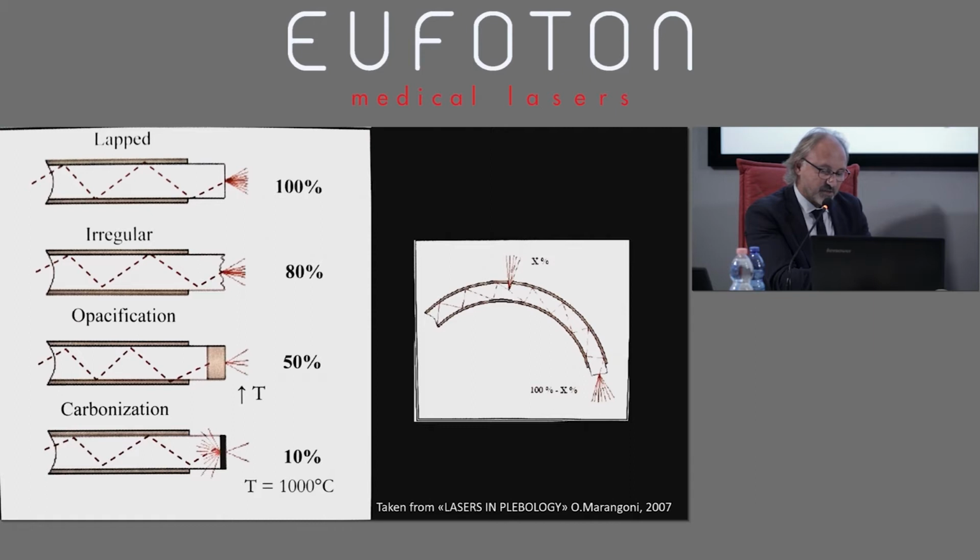I put the tip on the glove, and if the energy emission is not so well defined and sharp, maybe the time has come to change the tip of the fiber. So the good laser light emission seems to affect the result. If the tip is like a lens with some light diffraction, the wavelength is going to change. You get inflammation, and do not achieve the biological targets.